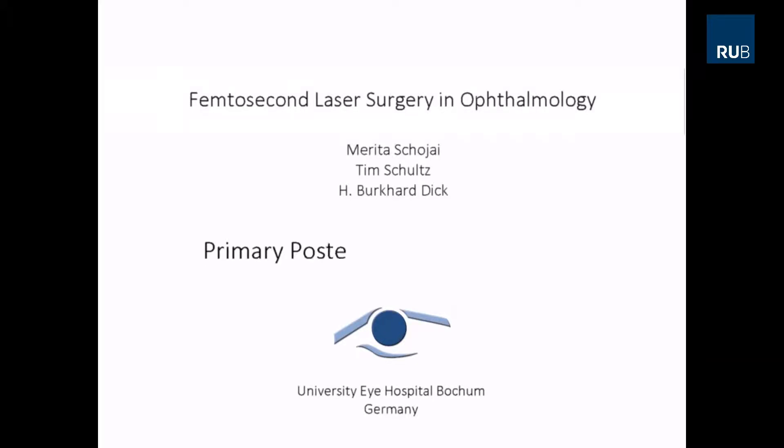In this video we present the technique to perform an image guided primary posterior laser assisted capsulotomy after IOL implantation at the end of surgery.